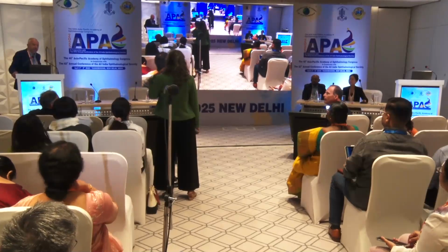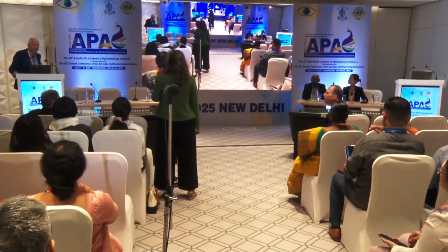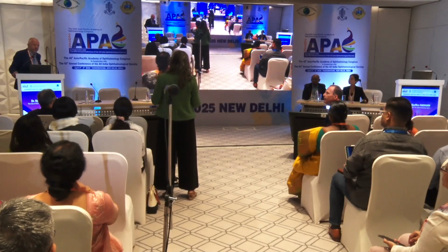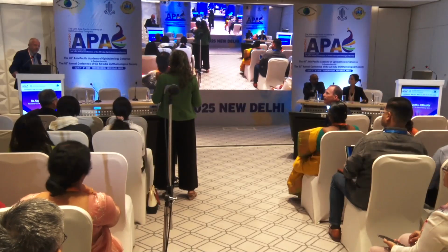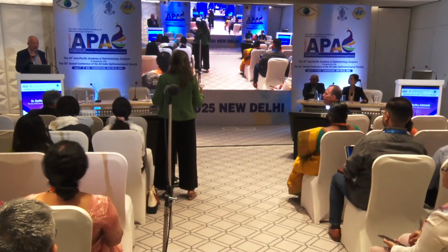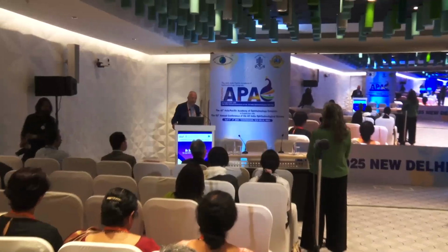That was wonderful. I think you may have an OCT in your pocket, right? My question is about the number. You talked about OCT number, but what's your take on stability? A lot of literature says if it's stable, you can follow pseudopapilledema. If it's stable, is it allowed to change more than 10 microns from visit to visit? Well, good question. That depends very much on the age of the patient.